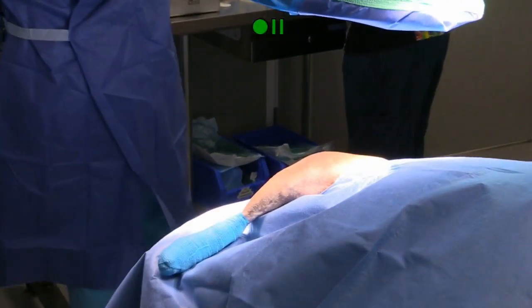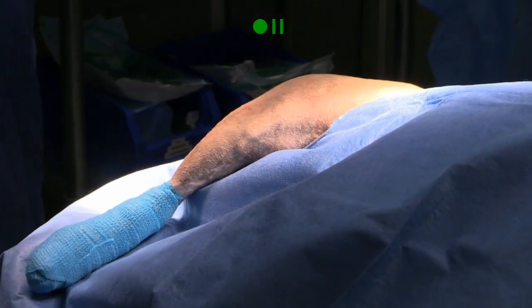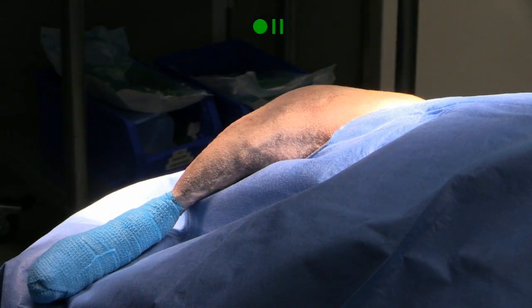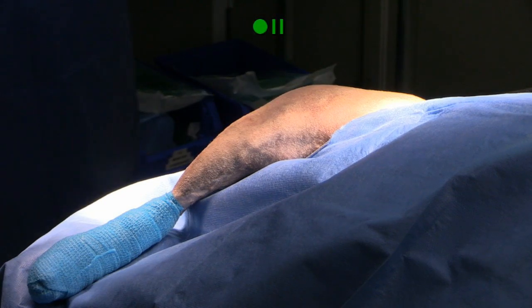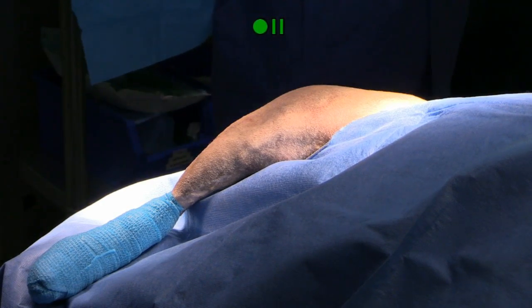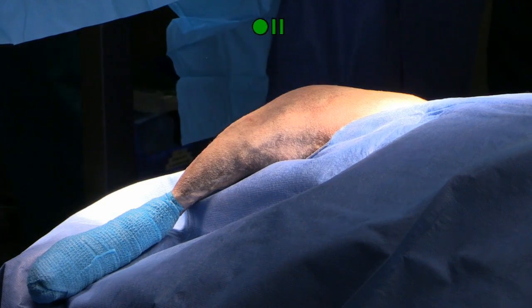Grab the screws to start, I just want to see what they look like, please. Can you have a little pen as well? Yeah, can I have some Kern forceps, please? So I'm going to start throwing as soon as I can on the cautery. Can you please?